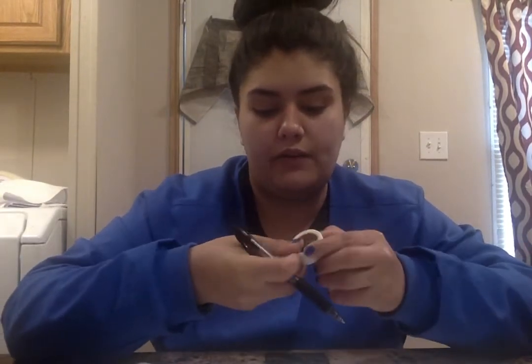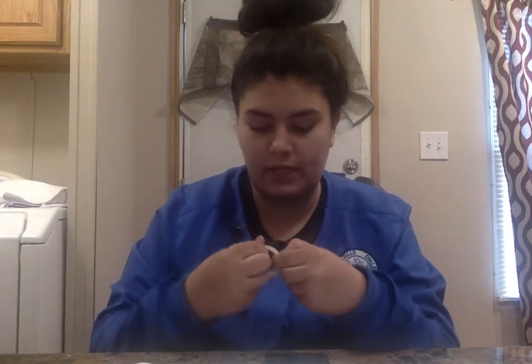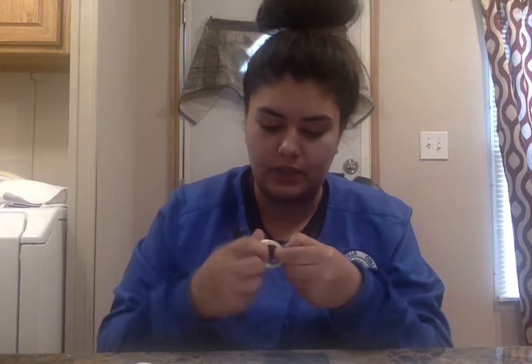We have our tape. We have our writing utensils. We have our gauges. We have the right syringe sizes. We have our alcohol prep pad. And then we have our medication cups to put our furosemide in.